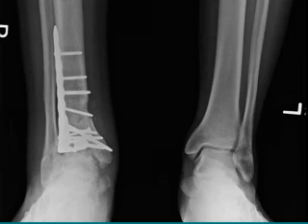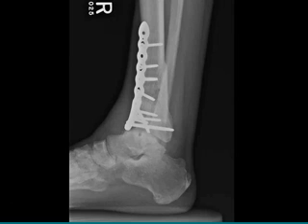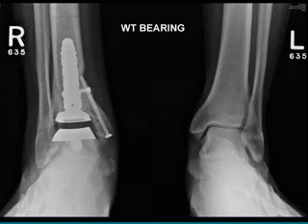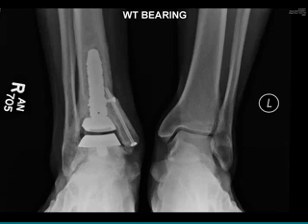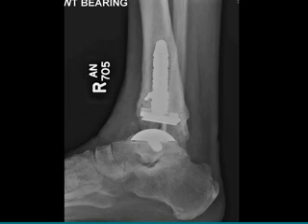But here in this case, we have a large plate. We're worried about a little avascular necrosis in the distal tibia. You can see it just doesn't look right. So I went in and I put the prosthesis in, but lo and behold, he had a large non-union across the distal tibia. But I thought, you know, that would heal, and I bone grafted it, put fixation in. I got a nice cut on the talus. But the question is, well, what do I do now?